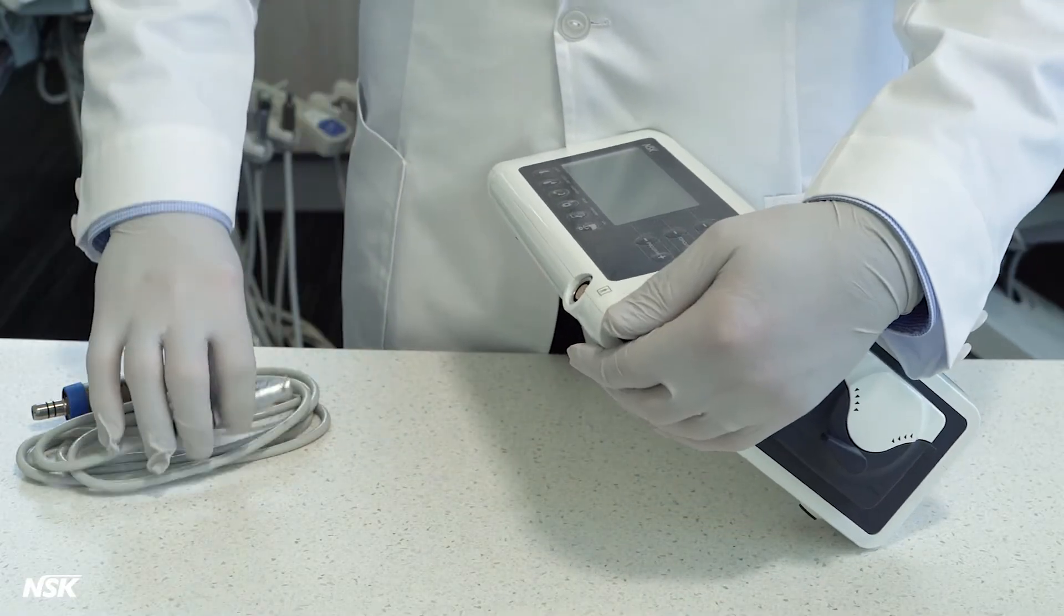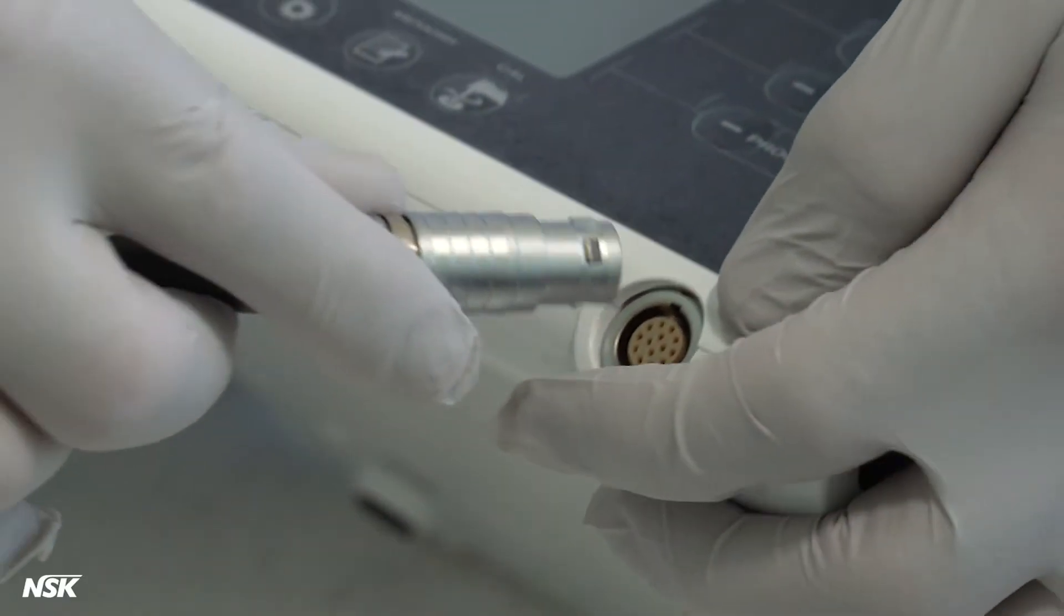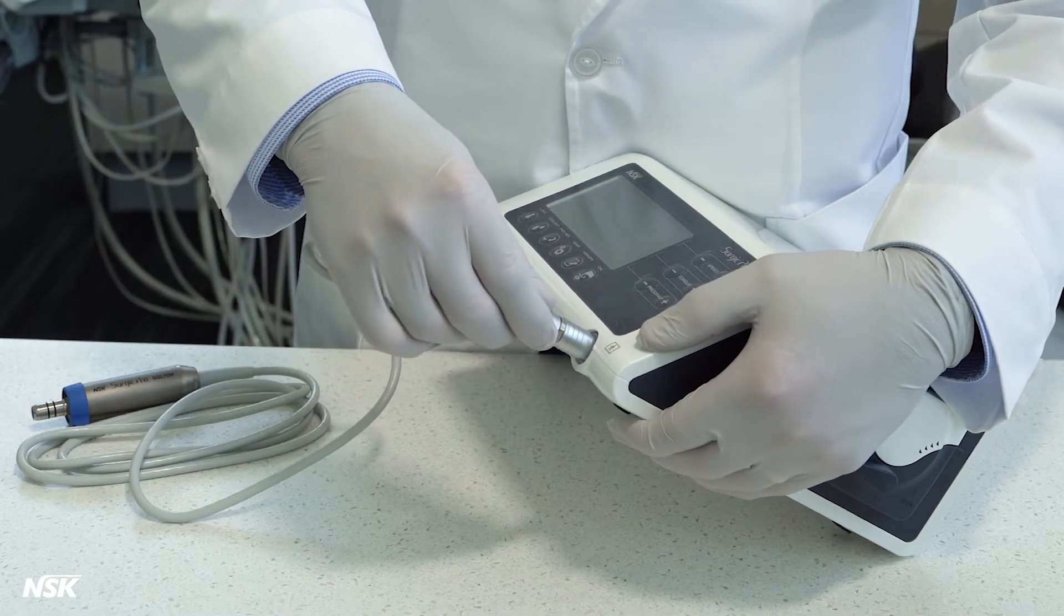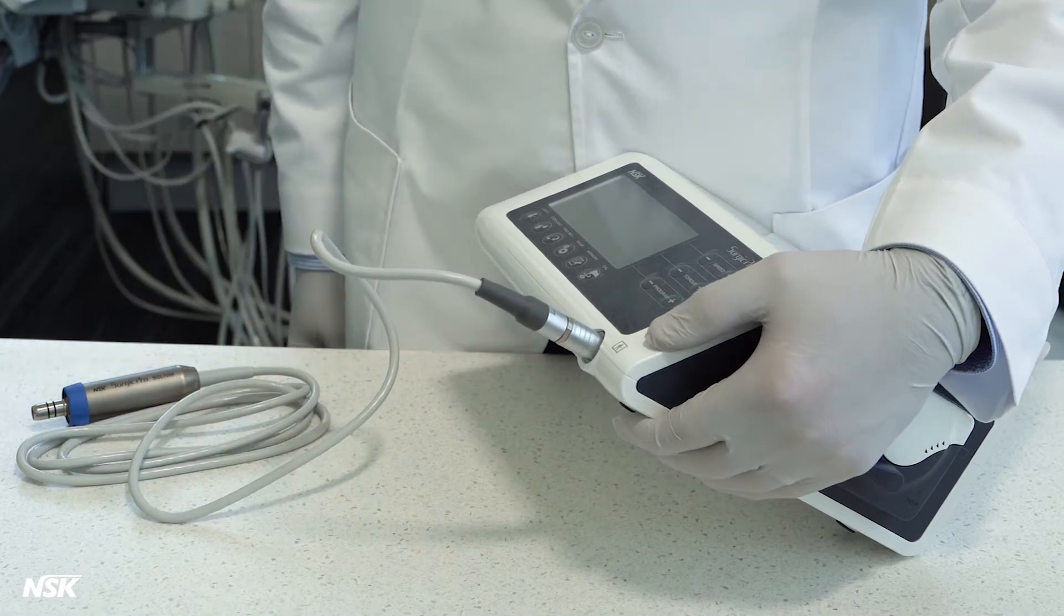Connect the motor cord by aligning the marks on the cord connector and the connection on the control unit. Push in the connector until you hear a click. Slightly pull the cord to make sure it's locked in place.